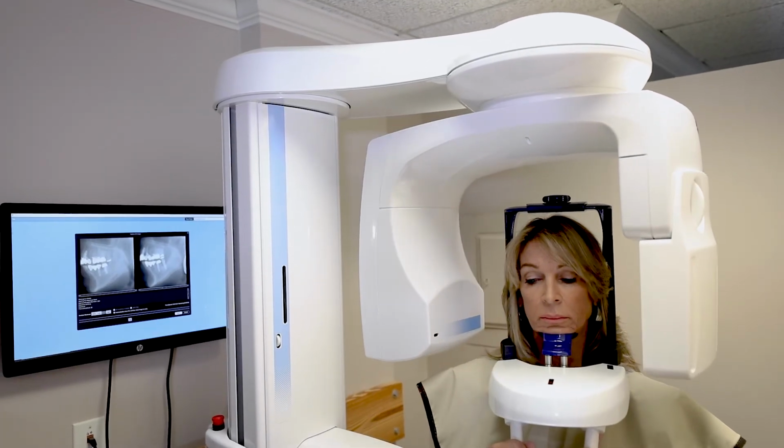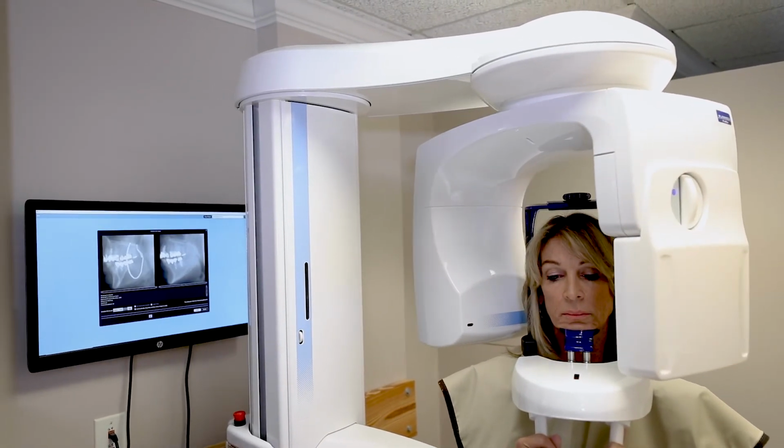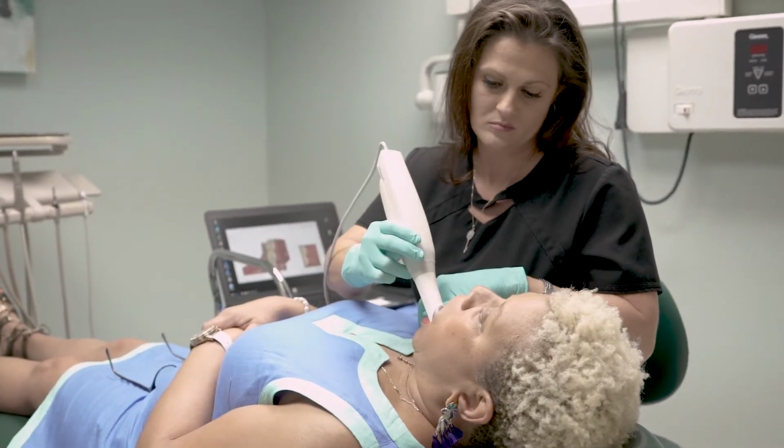This process requires first a sound plan. So the first thing we do at an initial visit is to determine the patient's history and then complete a workup involving imaging via a 3D scanner, an intraoral scanner, and some impressions. And then the following visit, the patient is ready for their surgical treatment. But a plan is put into place well before that visit for surgery. Once that plan is coordinated with the lab and a restorative dentist, we sit down and do the surgery.